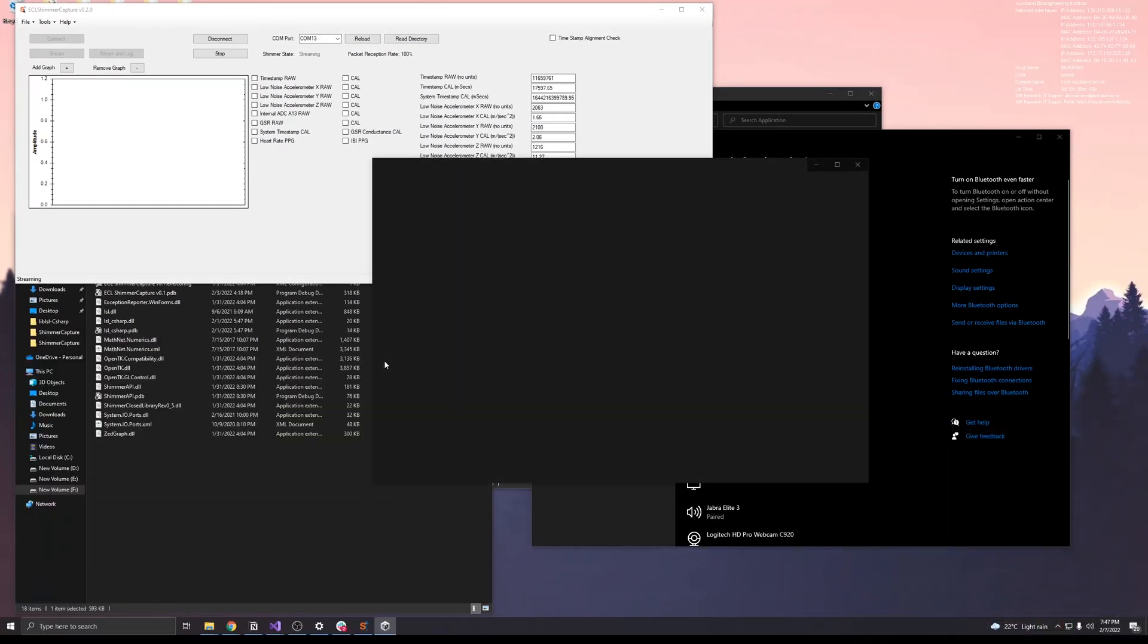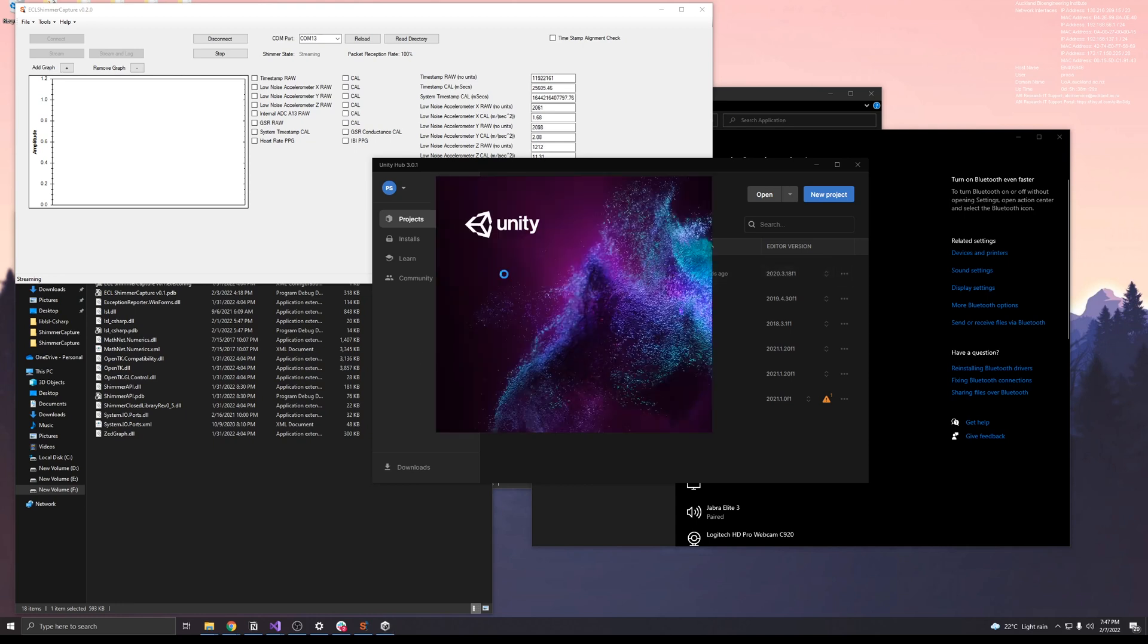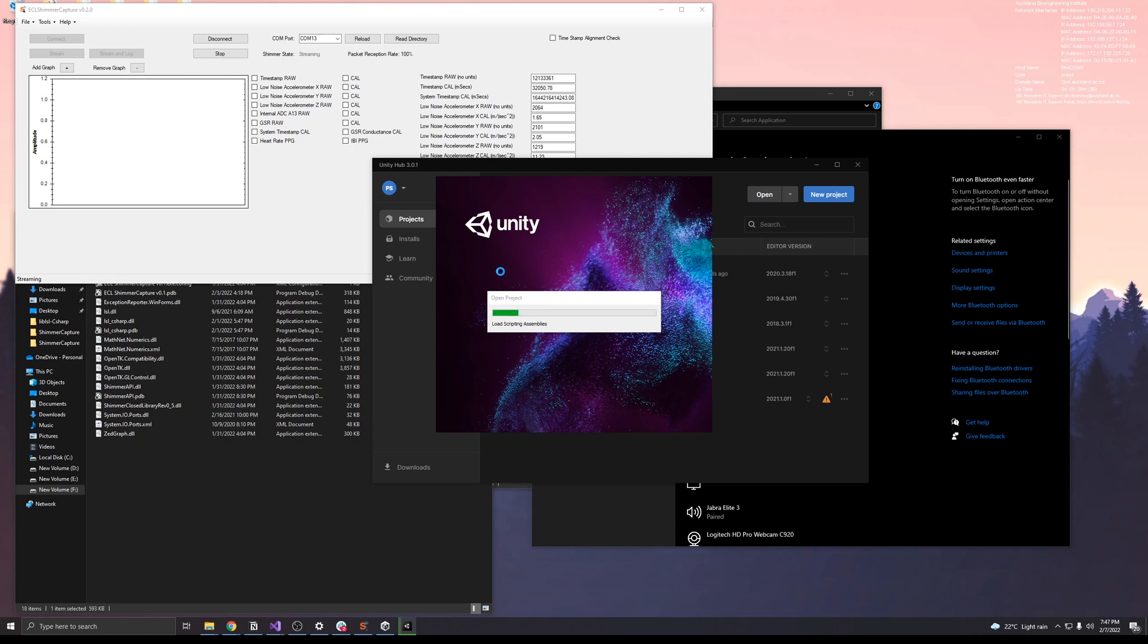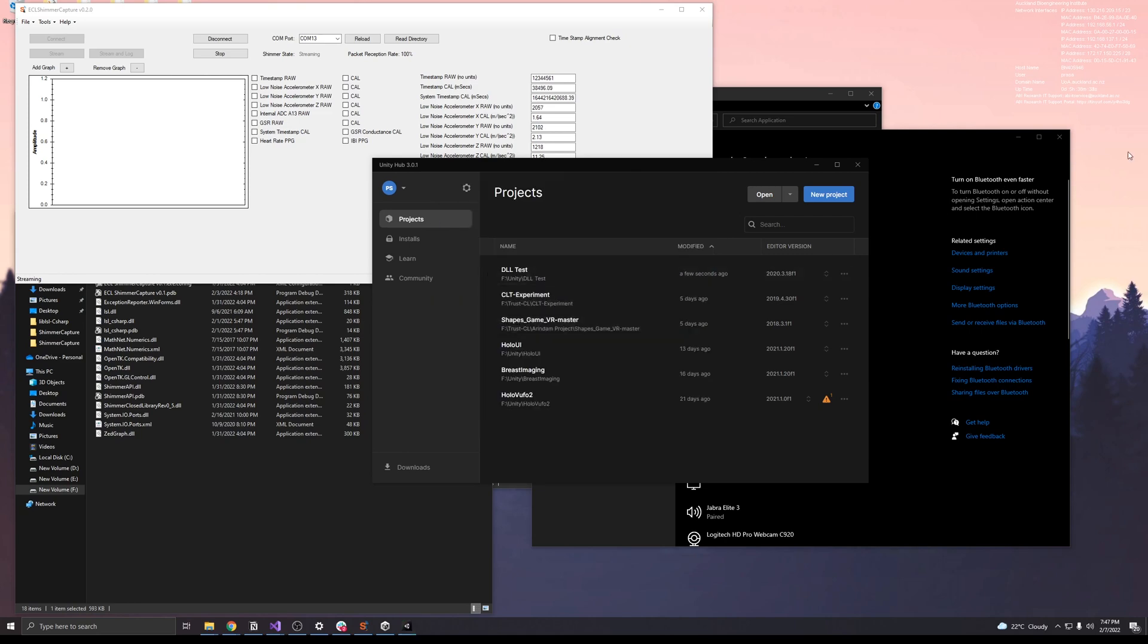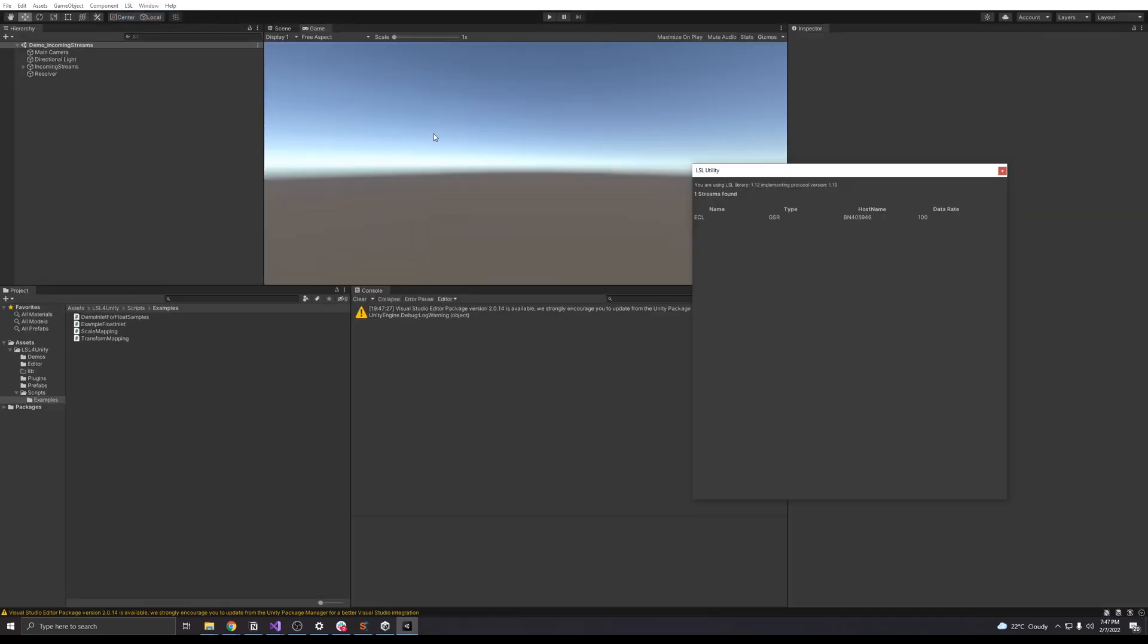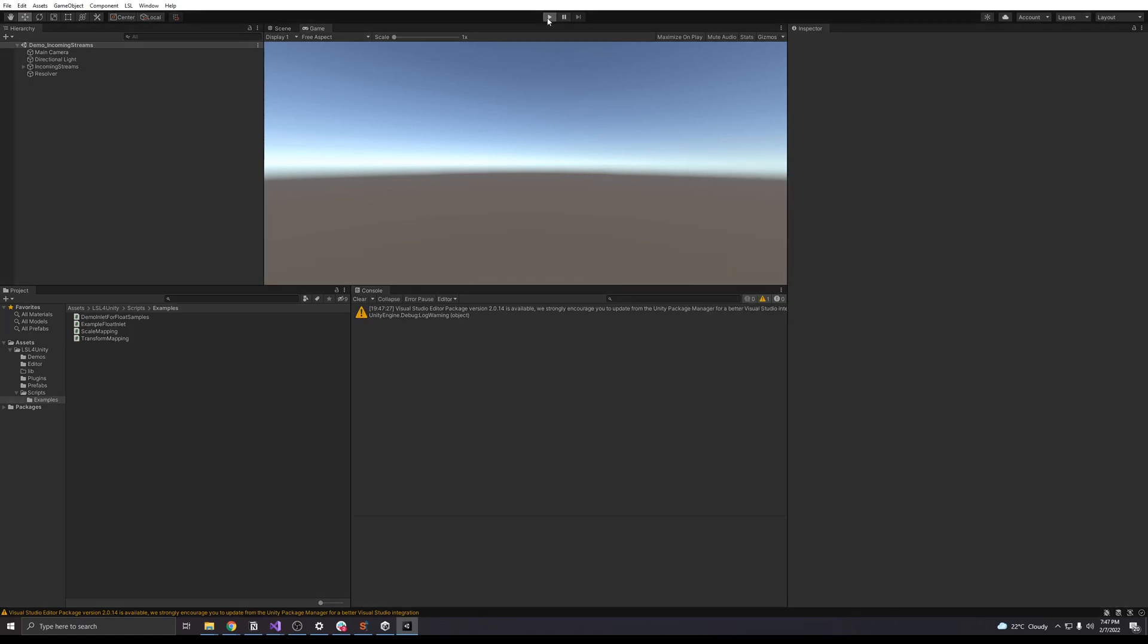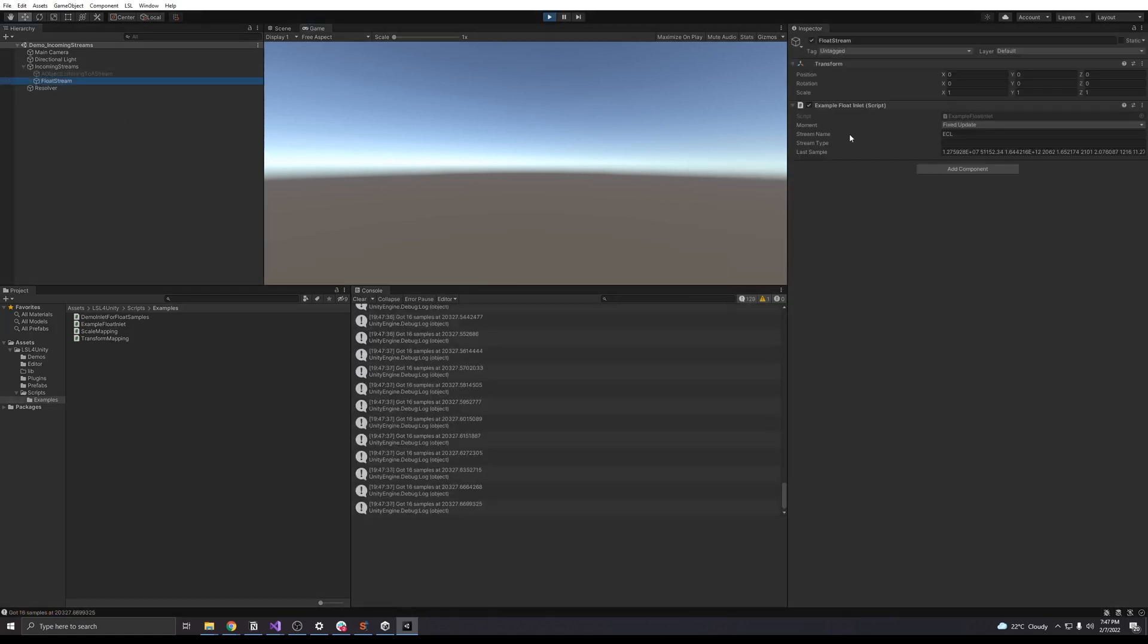I'll link the GitHub link in the video description. Once inside Unity, you can look up the LSL streams to see the stream. This is not a modified application, this is a default LSL application. Click on play.